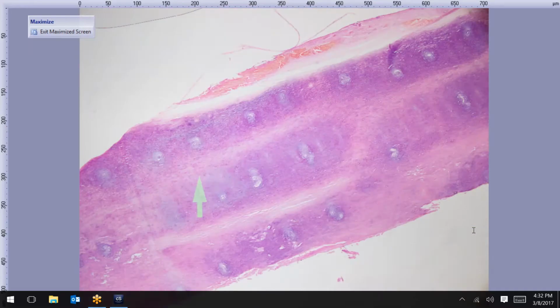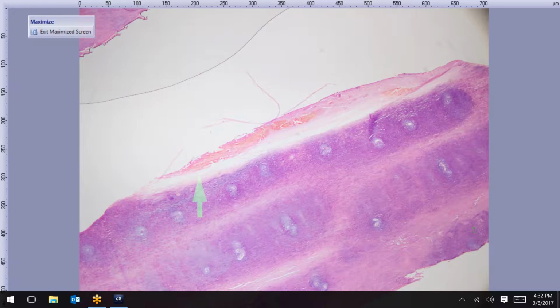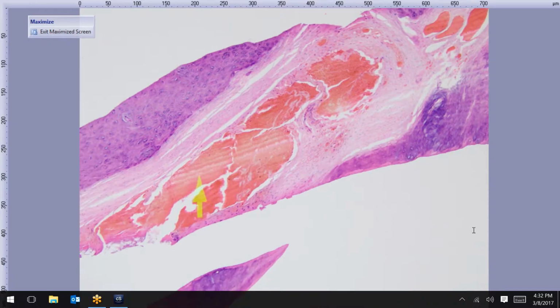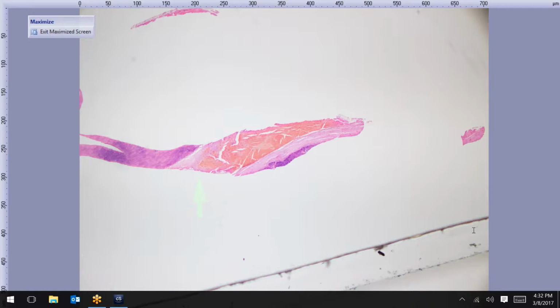All right, we have this big chunk of someone's heel without epithelium available, and this big focus of hemorrhage. Yeah, talon noir, that's perfect. So yeah, hemorrhage in the stratum corneum. We don't happen to, maybe a little epithelium there, but this is talon noir.